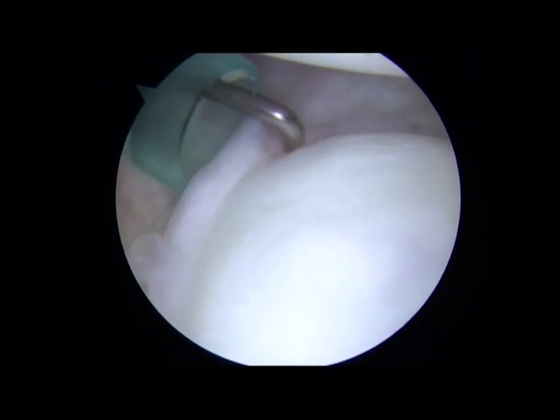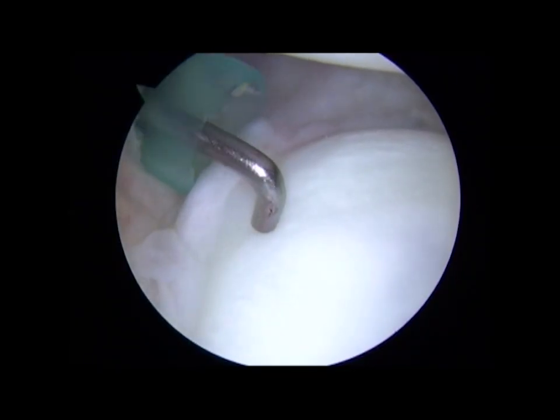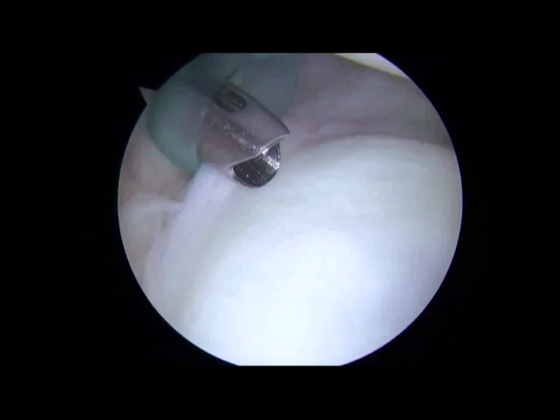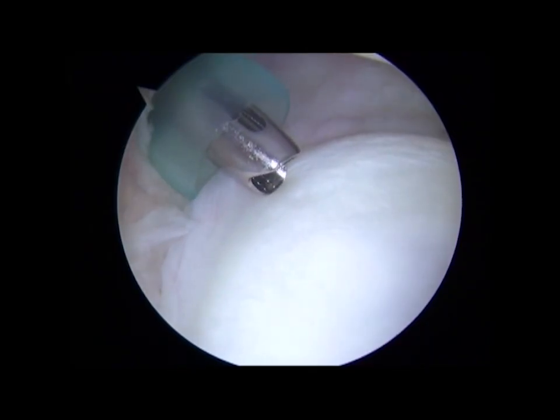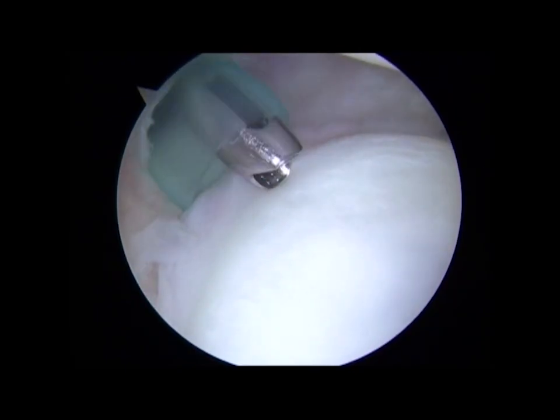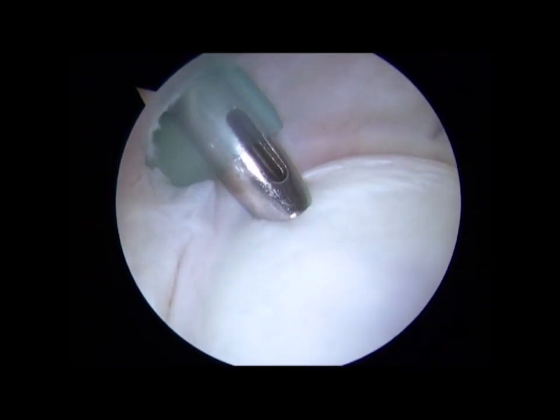One option would be to separate the labrum from the bone to help identify that by creating a labral detachment. Another might be, as shown here in this example, carefully using the drill bit guide to find the area between the labrum and the bone, which then allows the surgeon to appropriately drill the anchor into the glenoid bone itself.